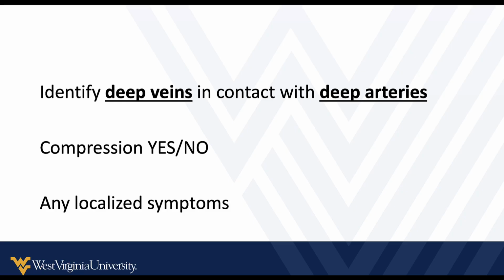Okay, some quick reminders. Identify the deep veins that are in contact with the deep arteries. The number one mistake people make is they just don't evaluate the anatomy appropriately and they get focused on superficial vessels. That's the number one mistake I see people make. Always make sure you identify the deep arteries first and look for the deep veins in contact with them. Once you find them, just look, does it compress?